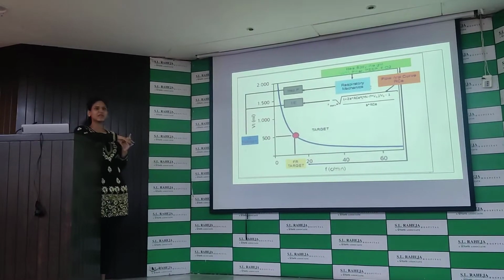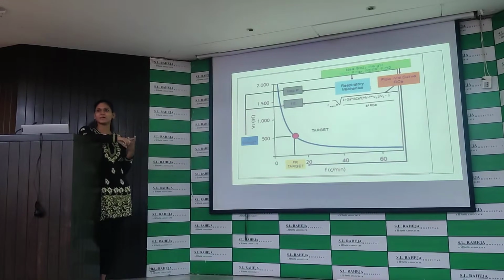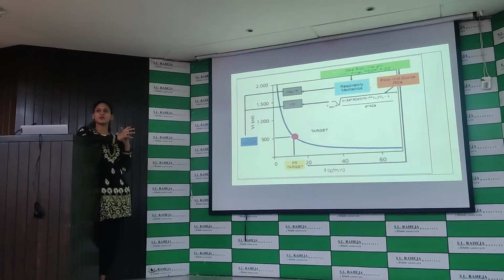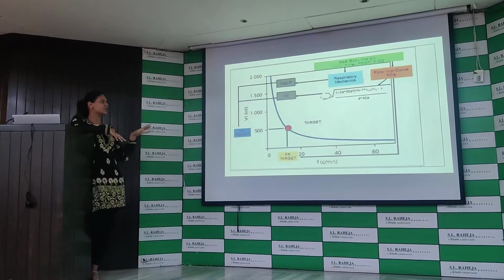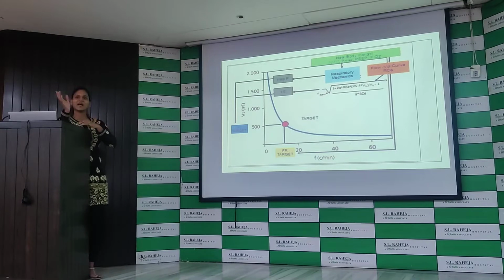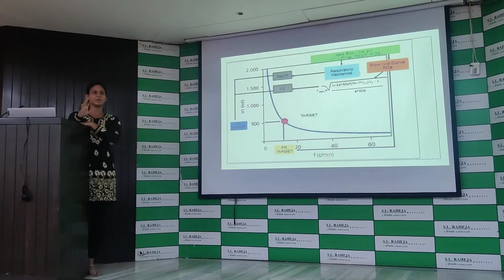Through the closed loop mechanism, it judges the respiratory mechanics, as in the compliance and the resistance, and puts them into the Otis equation. From there, it tries to come to a safer tidal volume and respiratory rate so that the minute ventilation is achieved. It also adjusts the IE ratio and the inspiratory pressure. So it calculates everything through these equations and comes to an optimal R.